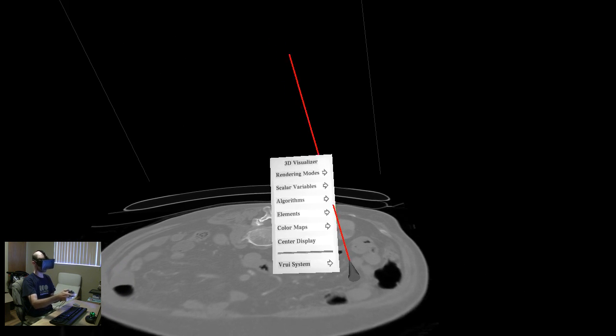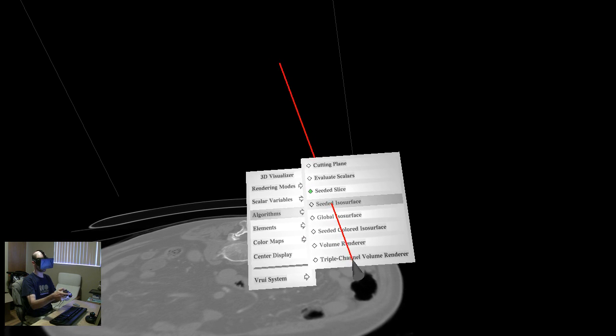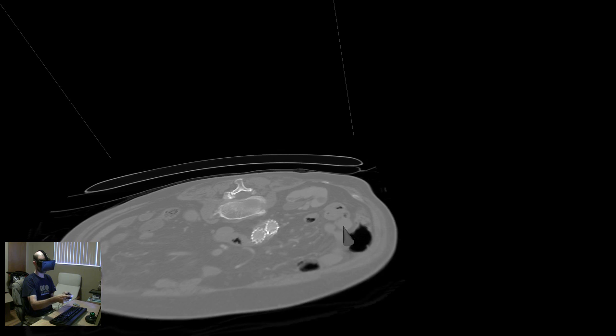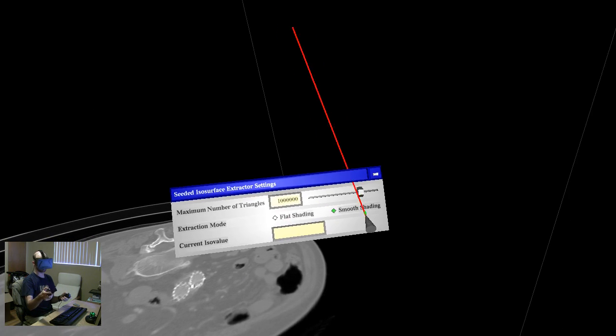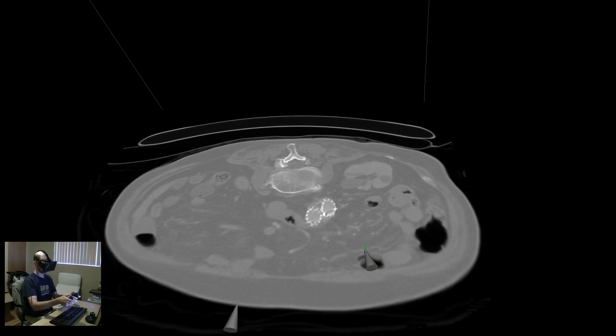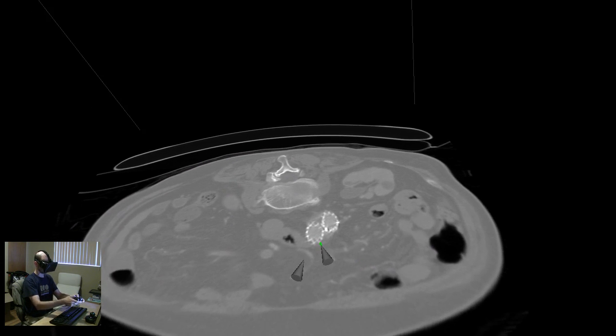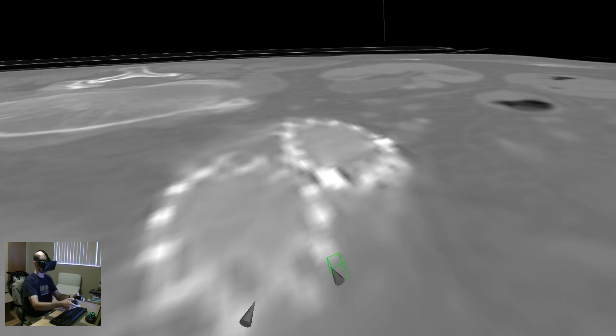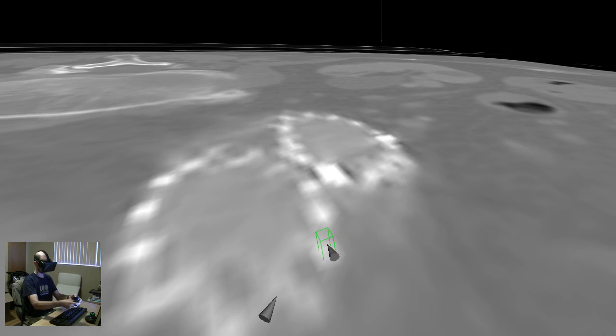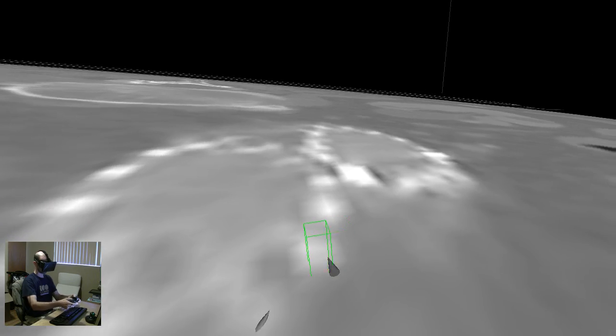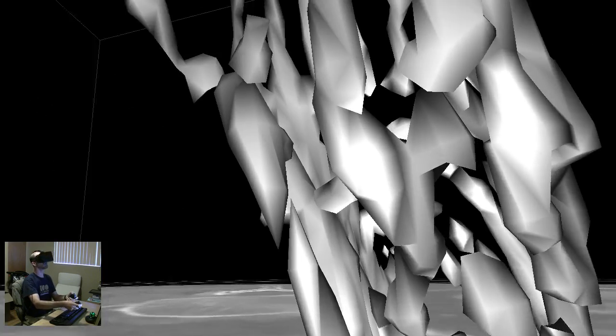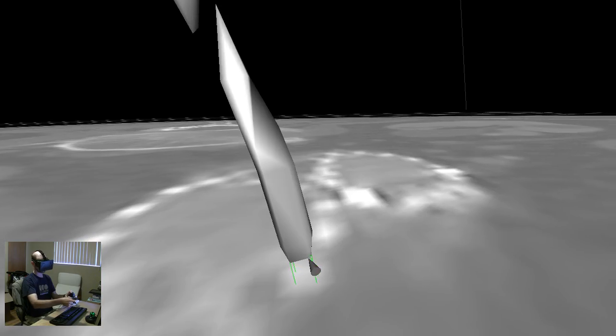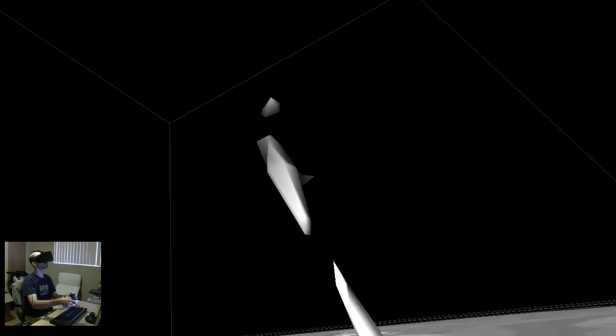You can make multiple slices and kind of create a mental model, but it's not really ideal. You have a 3D visualization package, so you want to really see things in 3D. For that, I'm creating the companion tool to the slice, which is an isosurface, which will connect all the points having the same data value, in this case density value, than the one I'm touching. So I'm going to zoom in to this slice here, and then touch this point and press the button.